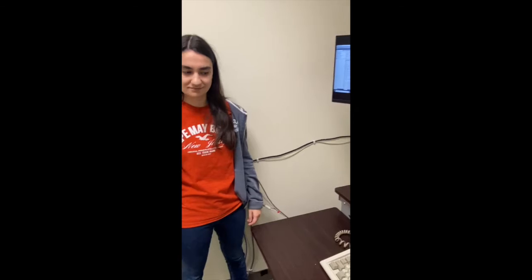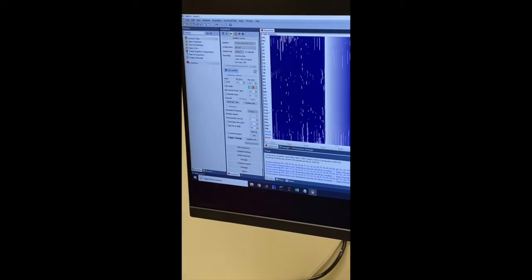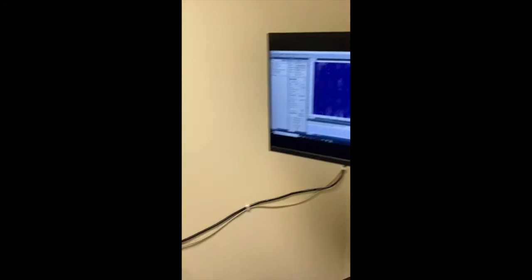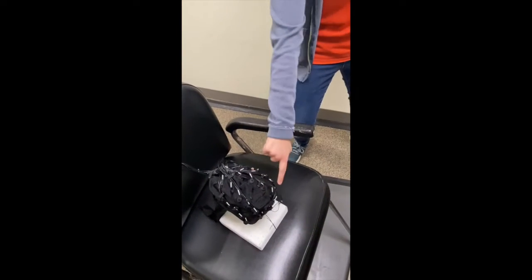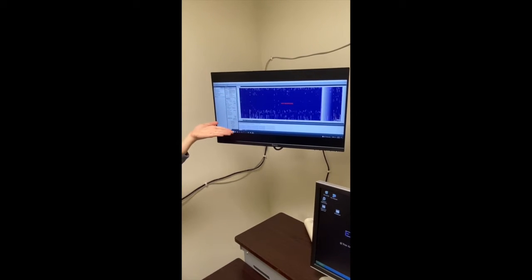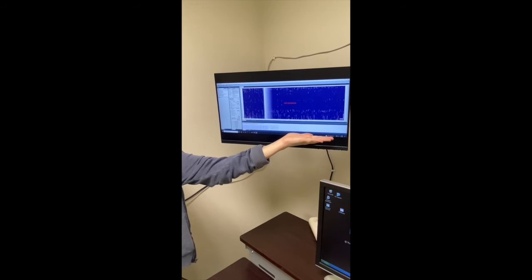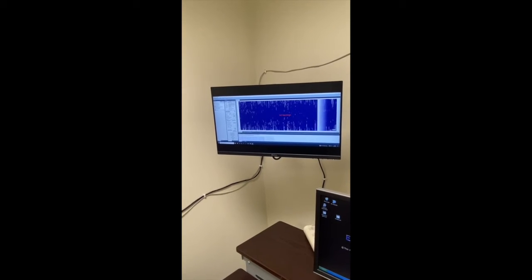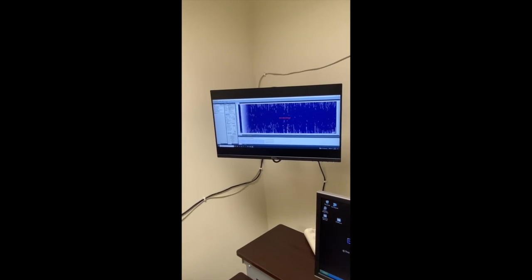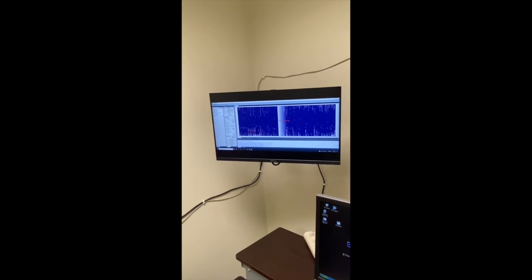Once you return to the research participant, tell them that the letters and numbers to the left of the graph all correspond to a different electrode on their scalp. Explain that the y-axis tracks the voltage of an electrode, and the x-axis is a measure of time passed. After data processing, this allows us to track the time and electrical activity after a specific event, like a word, sound, or image has occurred.